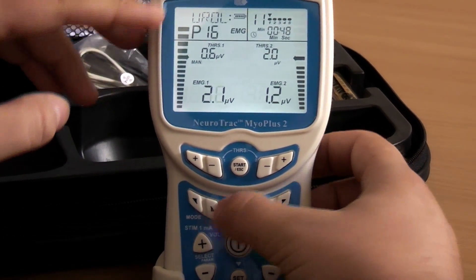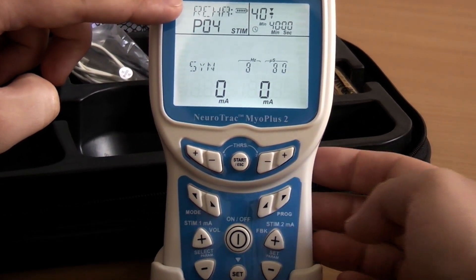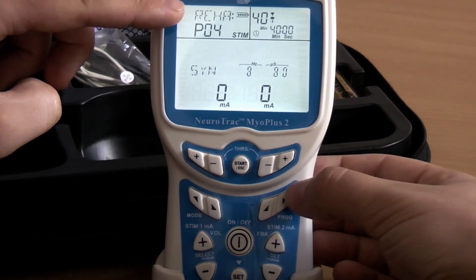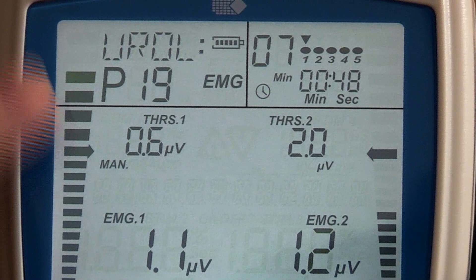For example, press the mode button to select Urol for pelvic floor and incontinence, Sport for sports and muscle development, or Rehab for muscle rehabilitation programs. By pressing the Prog button, you choose which program to use. For example, Urol 19, which is a preset program named Weak Pelvic Muscle.